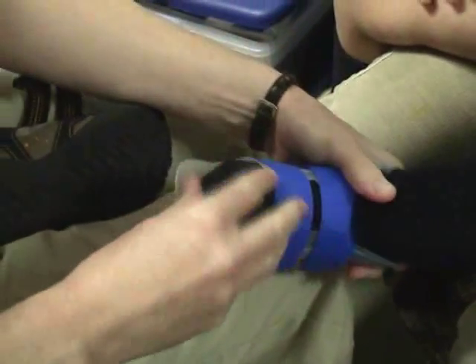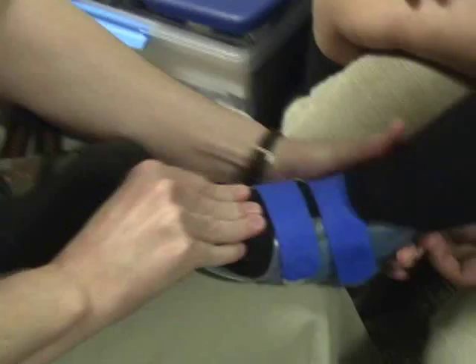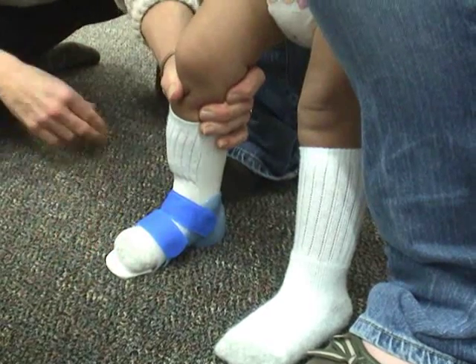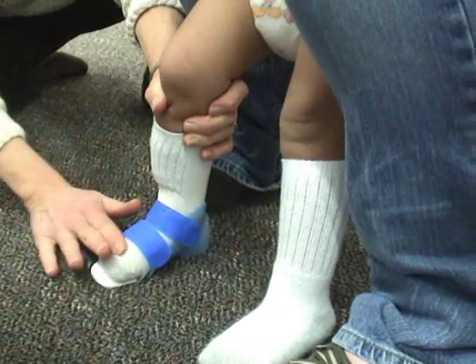If you're seeing the toes matching the end of the toe shelf, it's usually a case that the jumpstart is too small. If you see more than half an inch, it is possible that the jumpstart is too big.